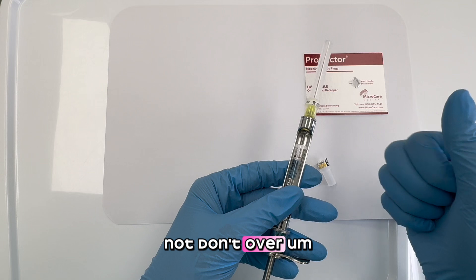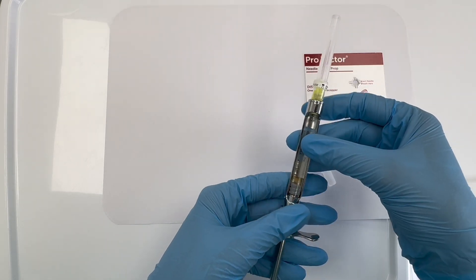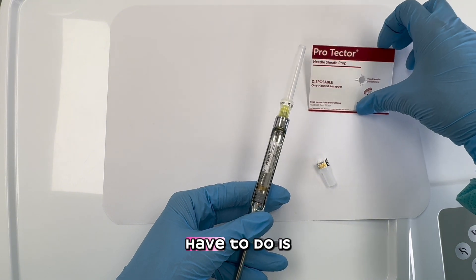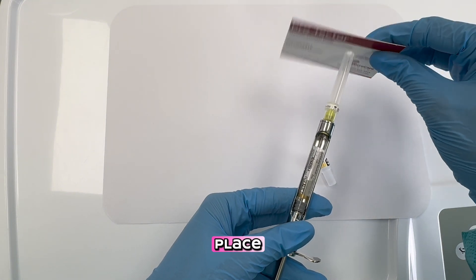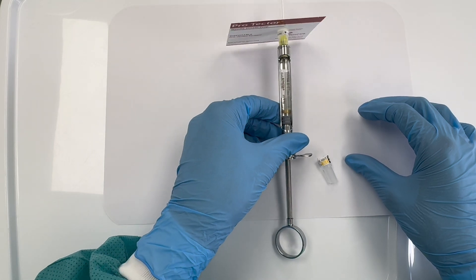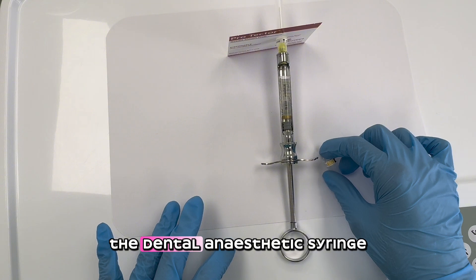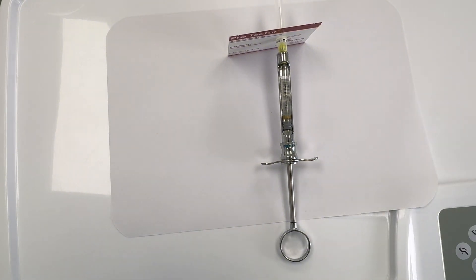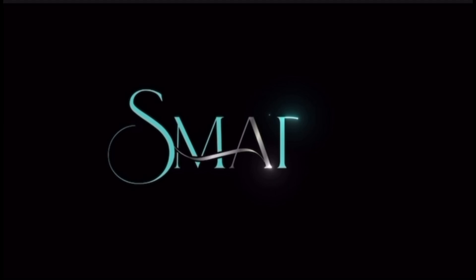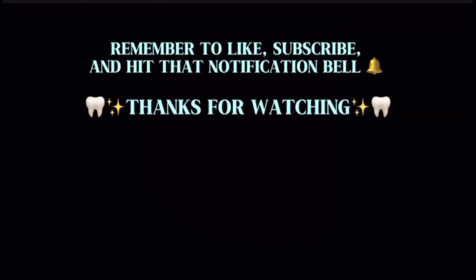Don't over-tighten the needle. The last thing we have to do is place the sheath protector. And that's how you assemble the dental anesthetic syringe.